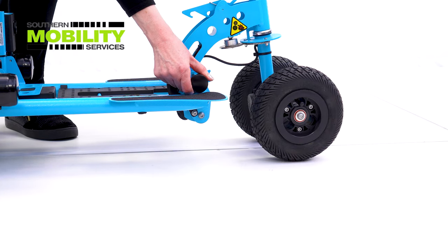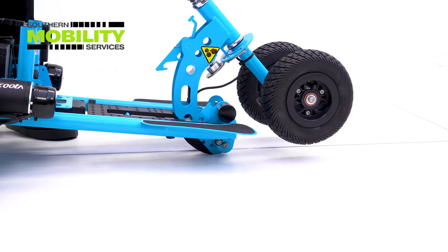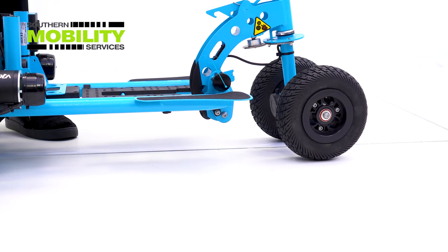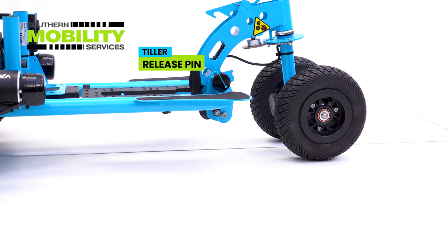Now we're showing you just how easy it is to lower the tiller. You pull the release knob and drop down, then lift back up and it automatically clips back into place, and then off you go.